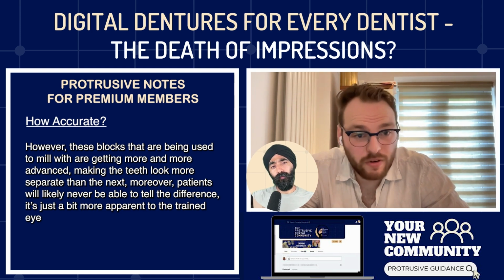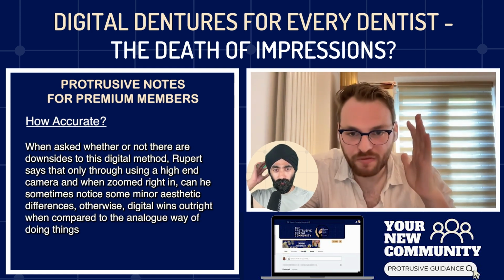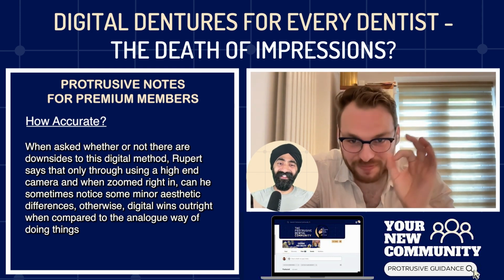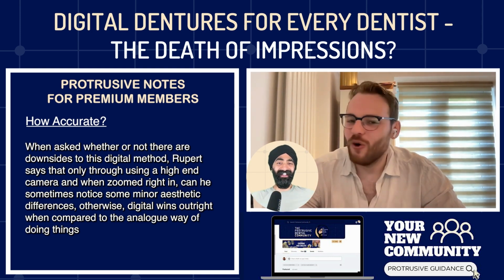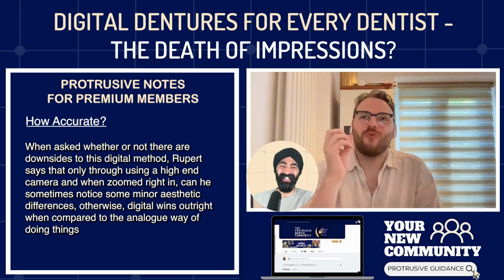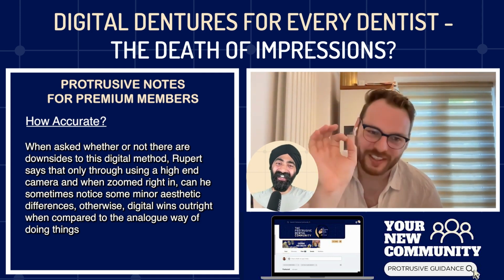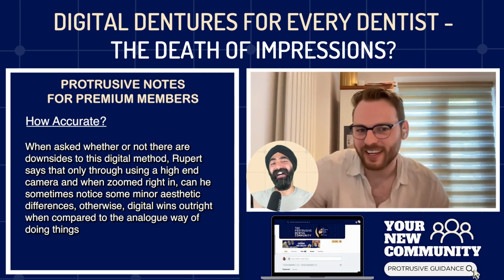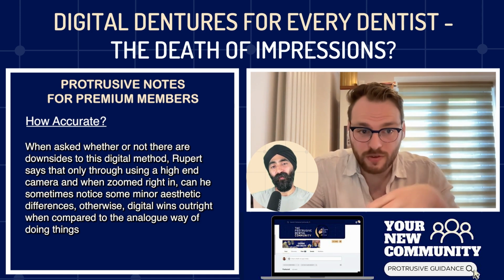So the only inferiority is when you're really, really macroing in, and I take my big photos and I sit there polishing off all the dark denture spaces on Photoshop. When I've got the macro flash on it and my 40 odd megapixel camera, I can see the difference minorly aesthetically in the teeth and things. Beyond that, there's no real downsides from my perspective.